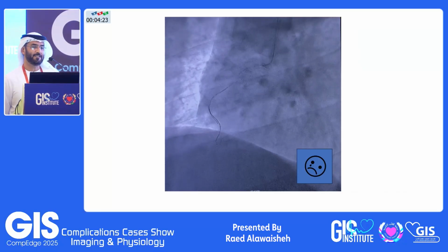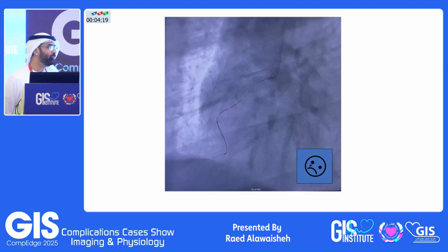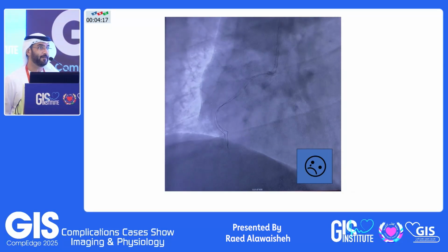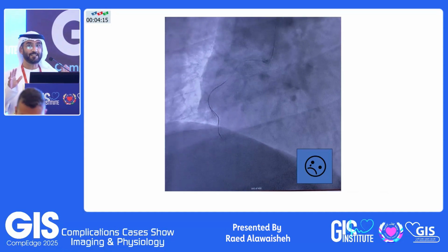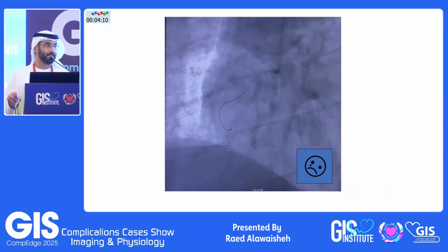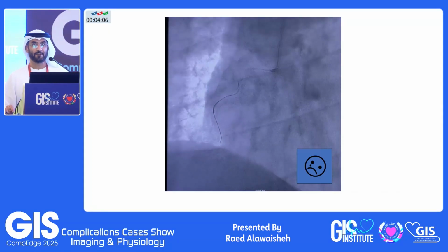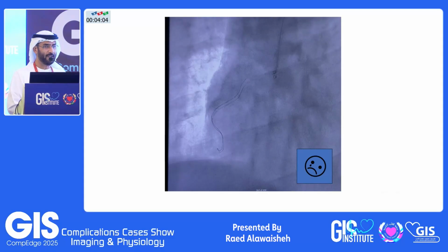That's my point. This video is a bit long, but it tells you what's happening when you start getting panic, and you only concentrate on passing the wire, not the patient's safety. There must be something in your mind that something is wrong. Don't just want to cross the wire.